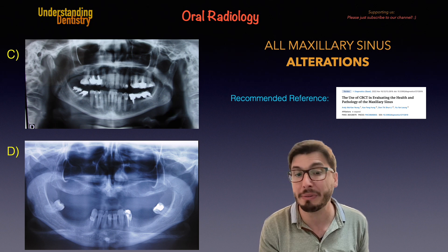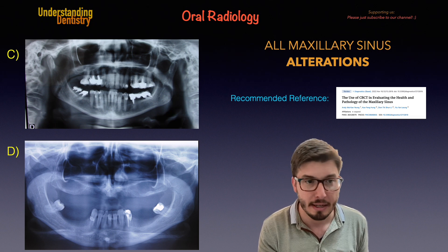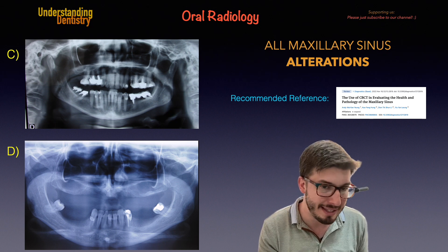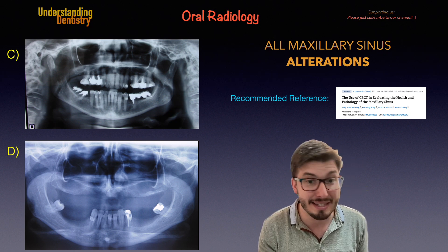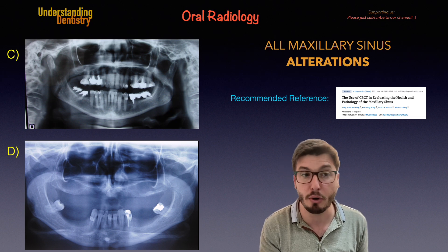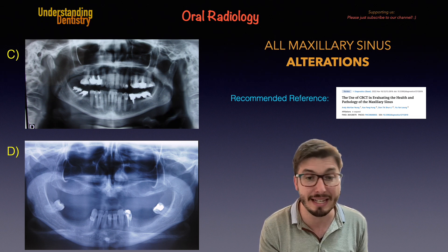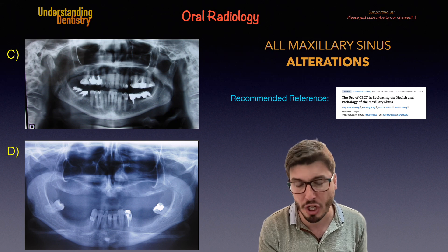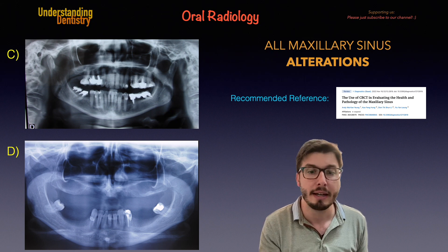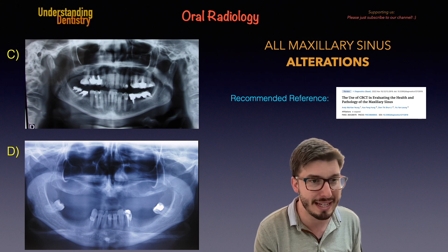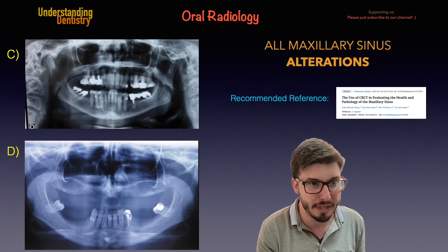Septa is the plural, septum is the singular. So we have a bone septum here. This is a sinus variation, so it can be present or not. We see this in a 2D image, like this OPG, with a W-shape — the W-shape showing us that there is a bone septum there.